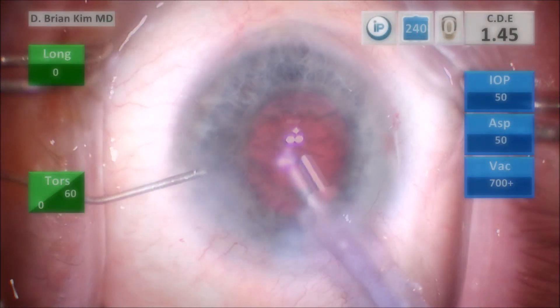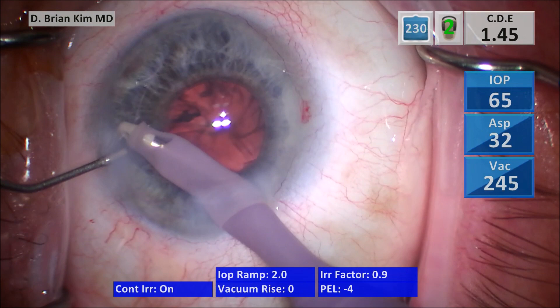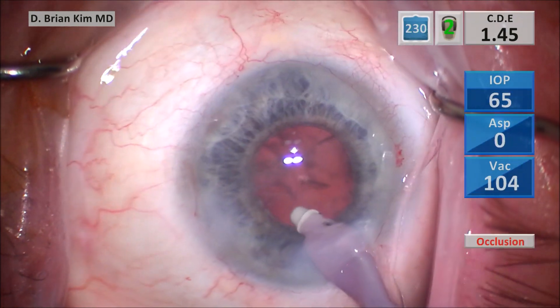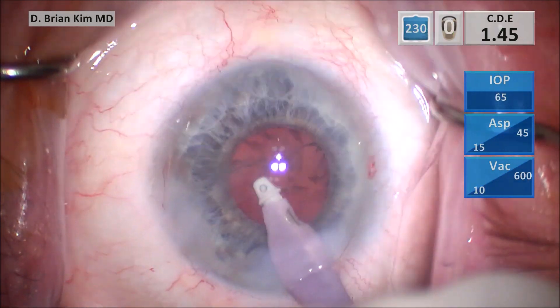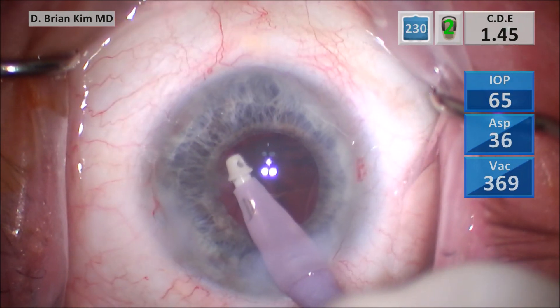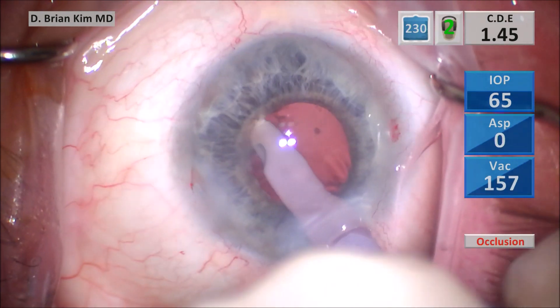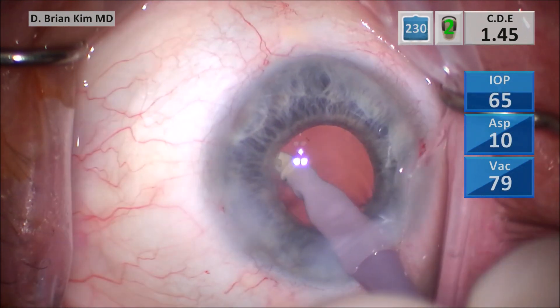I take the chopper out, push BSS in, take the phaco tip out, and switch it with the IA handpiece. The sleeve is pushed up a little bit toward the tip, so I'm going to retract the sleeve a little bit. I start sub-incisionally and sweep side to side, grasping the anterior component of the cortical material, peeling it off, and going around circumferentially using high vacuum. The polymer tip is really nice in this situation because I don't have very good visibility underneath the pupil edge, but I'm using foot pedal control to carefully modulate how much vacuum I'm using.